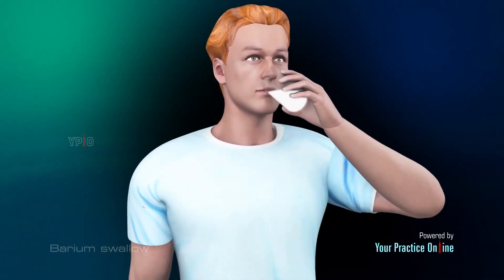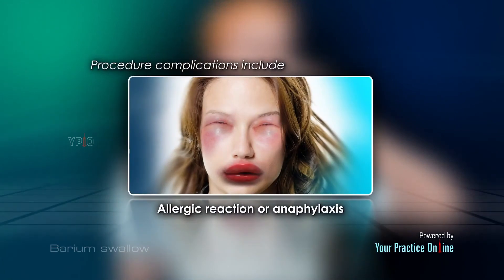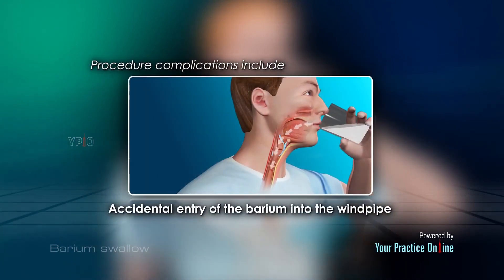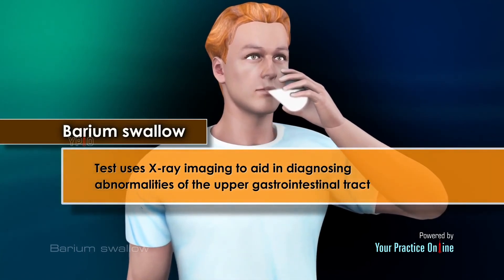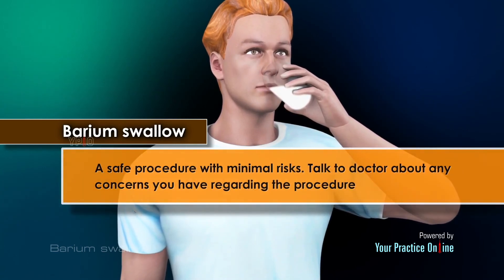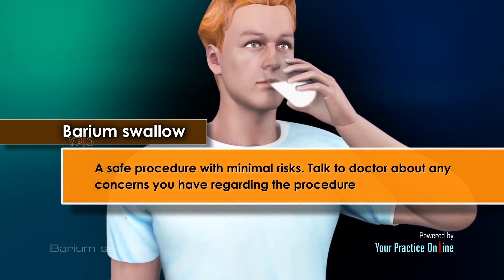The barium swallow is generally a safe test, but as with any procedure, complications may occur and can include allergic reaction or anaphylaxis, constipation, and accidental entry of the barium into the windpipe. A barium swallow test uses x-ray imaging to aid in diagnosing abnormalities of the upper gastrointestinal tract. It is a safe procedure with minimal risks. Talk to your doctor about any concerns you have regarding the procedure.